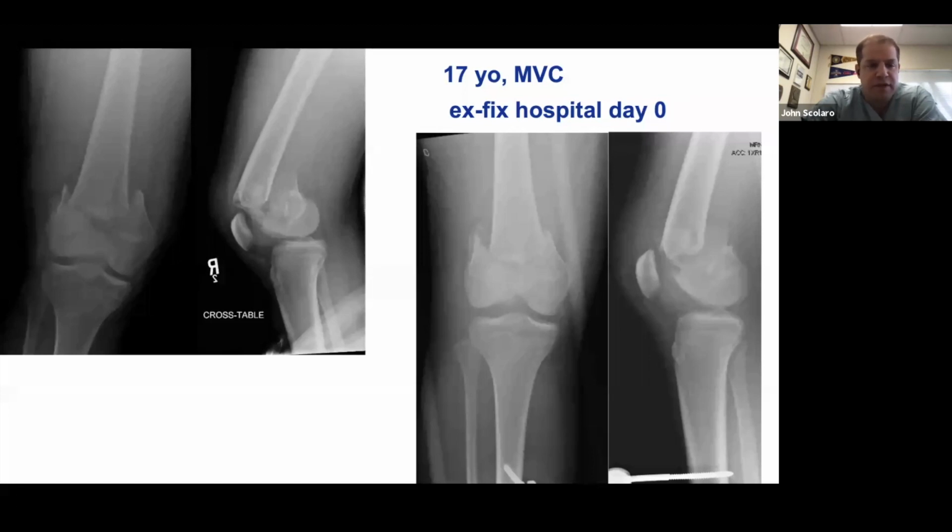Not only to be able to do an open reduction, most likely for the articular portion, but also looking at the metaphyseal reads. This is a shorter segment distally, and so I'm trying to see if I have something on the medial or lateral side that's going to be a nice key-in that will allow me to set the distal block onto the shaft. So probably looking to get a CT scan, and then just moving along.